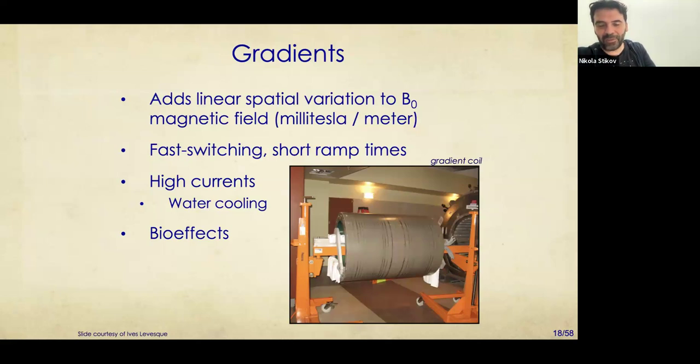So basically, you have electricity going through your tongue, and that usually activates receptors that make a weird taste. Now, it's not really easy to determine. It's not salty, it's not sweet. It's just kind of as if you put a battery on your tongue and then you get that metallic taste.